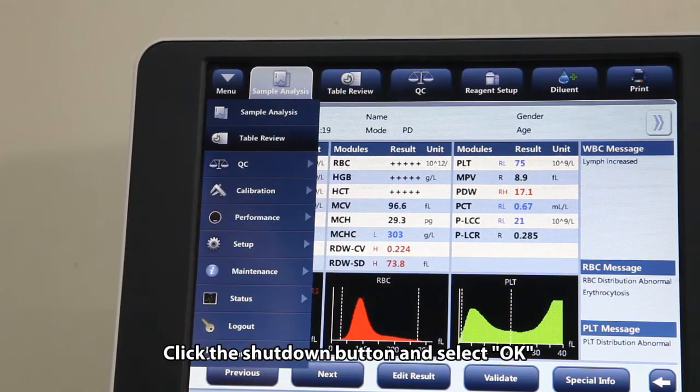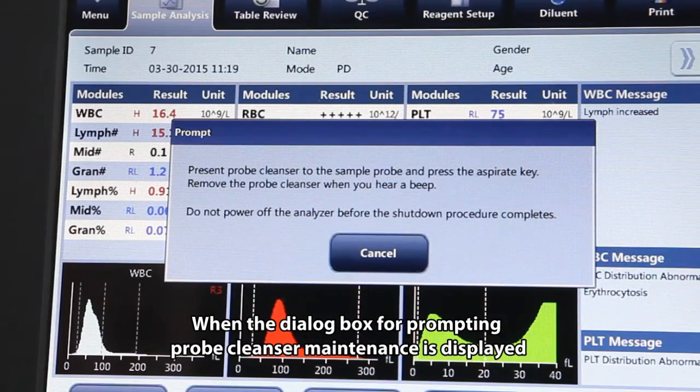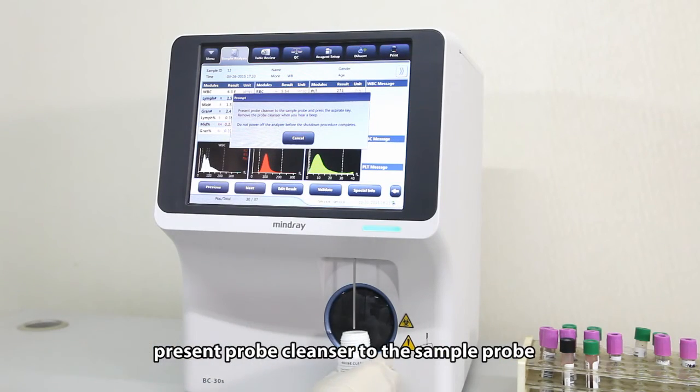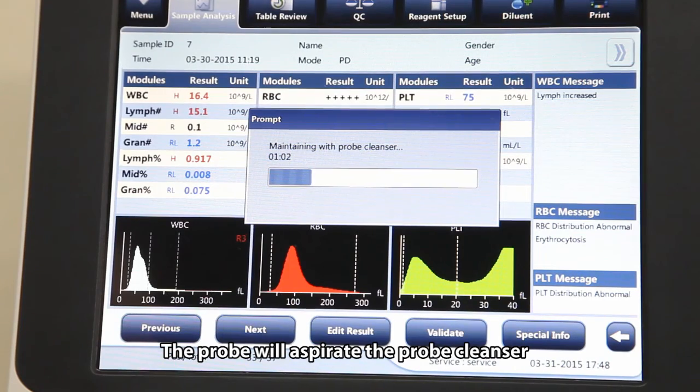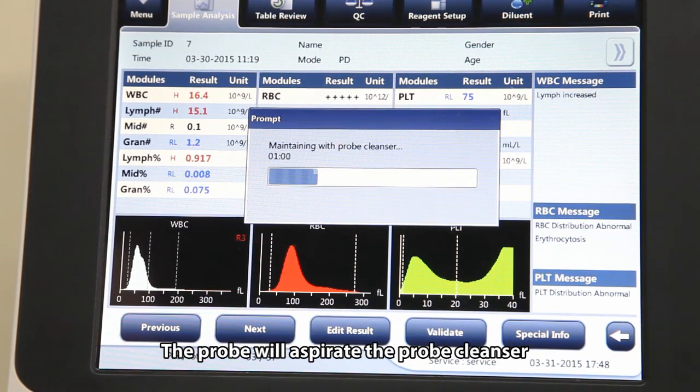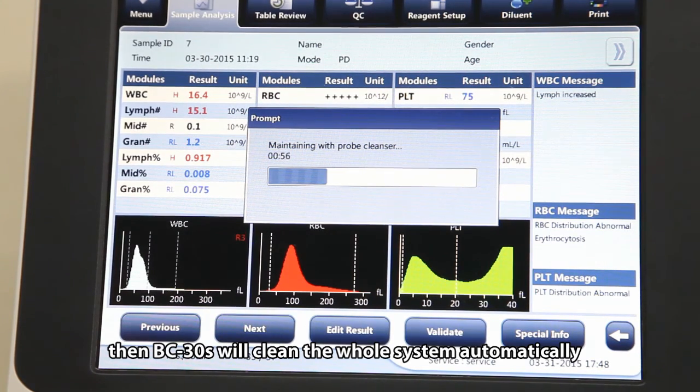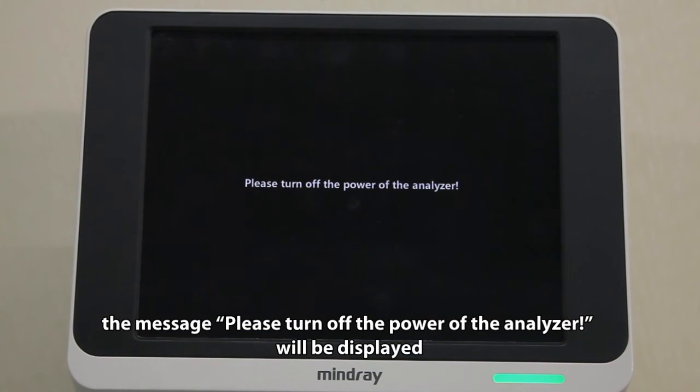Click the shutdown button and select OK. When the dialog box for prompting probe cleanser maintenance is displayed, present probe cleanser to the sample probe, then press the aspirate key. The probe will aspirate the probe cleanser, then BC-30S will clean the whole system automatically. After shutdown finishes, the message Please turn off the power of the analyzer will be displayed. Press the power switch on the back of the instrument to power off.